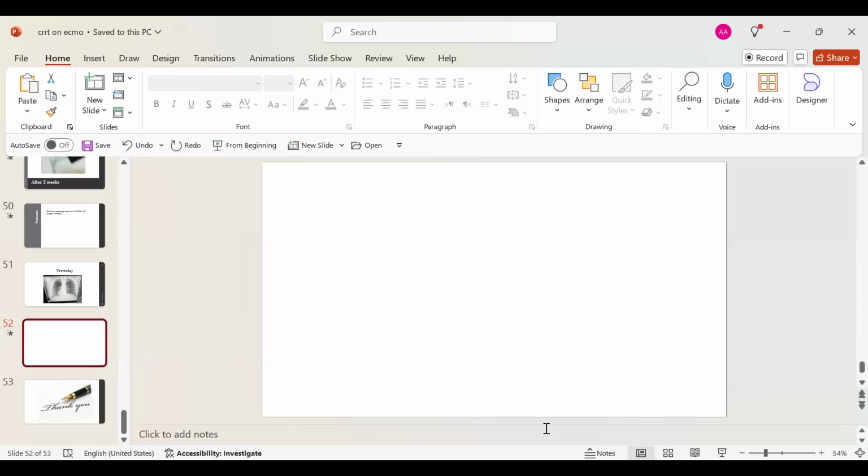So you prefer the use of the deoxygenated limb for insertion of the CRRT circuit, not even for extraction from the oxygenated limb. You use only the deoxygenated limb for input and output in Cairo University? Or we sometimes use other options, it depends on the circuit. We don't like to interrupt the circuit. We don't like to cut the circuit to put in the CRRT. So sometimes the connections force us to connect post-oxygenator. If this happens, we connect the drainage post-oxygenator and the return before the oxygenator. Return before the oxygenator. Okay.